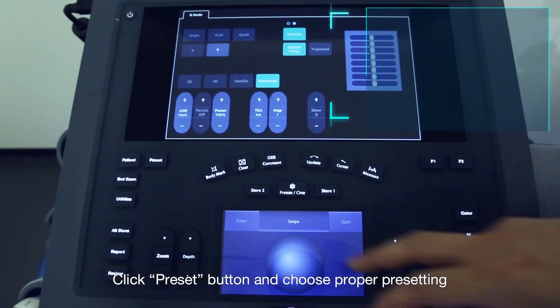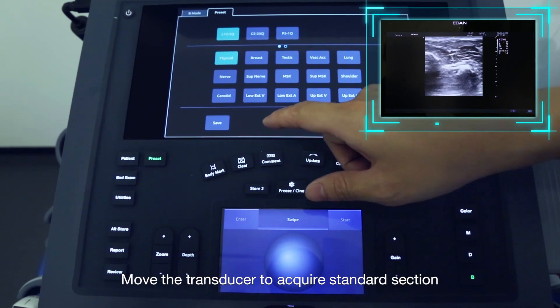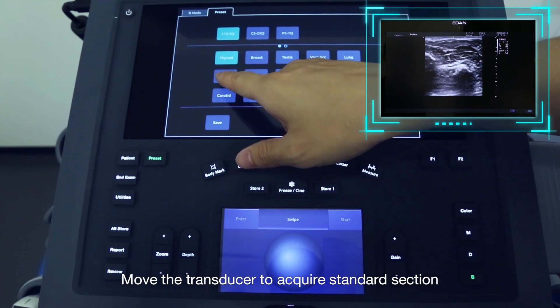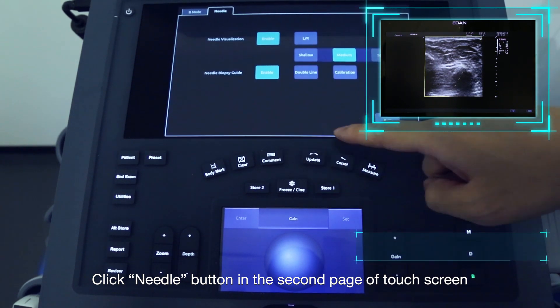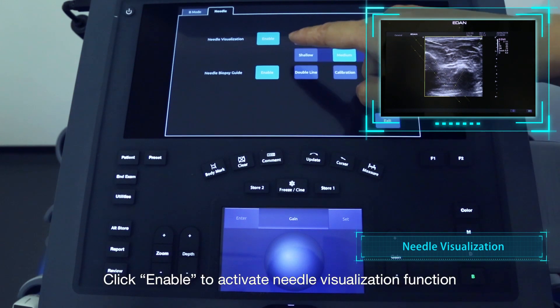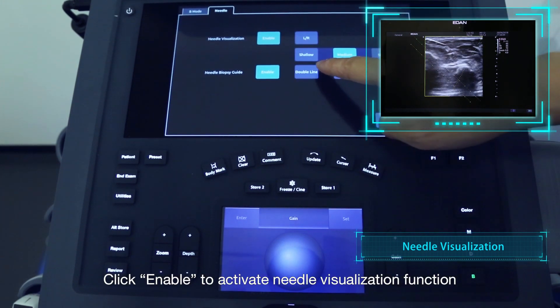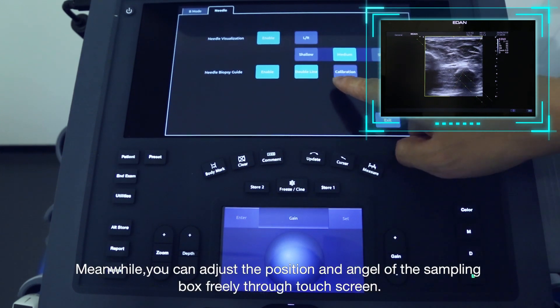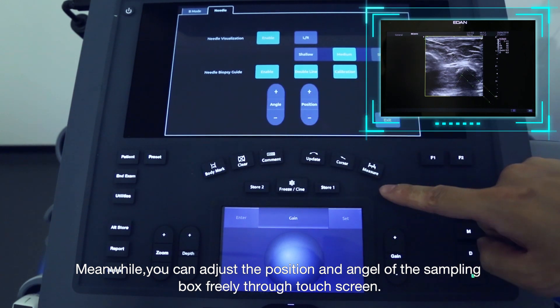Click the Preset button and choose the proper presetting. Move the transducer to acquire a standard section. Click the Needle button on the second page of the touchscreen, then click Enable to activate the Needle visualization function. You can adjust the position and angle of the sampling box freely through the touchscreen.